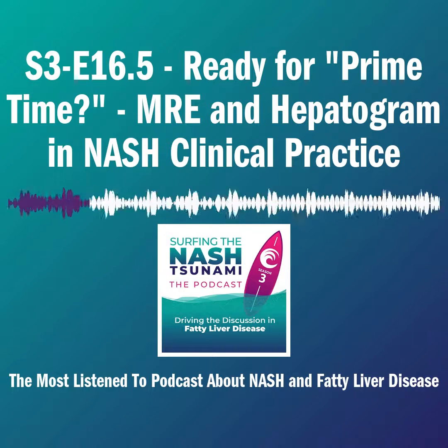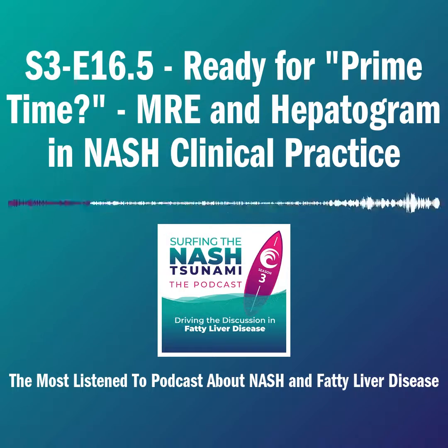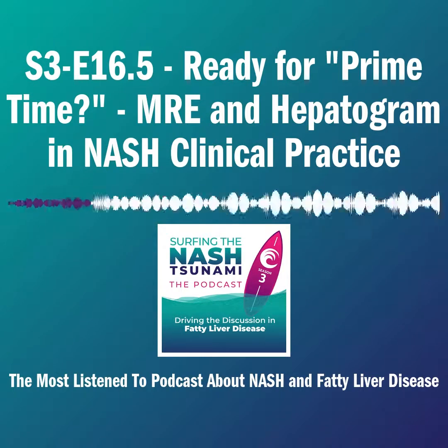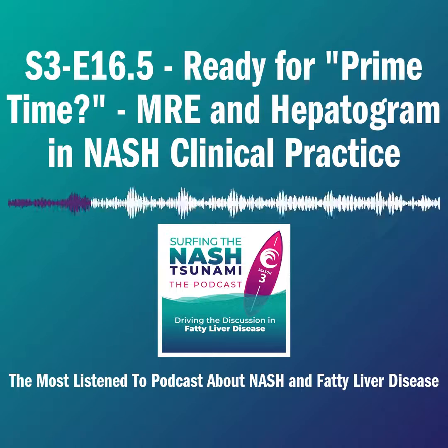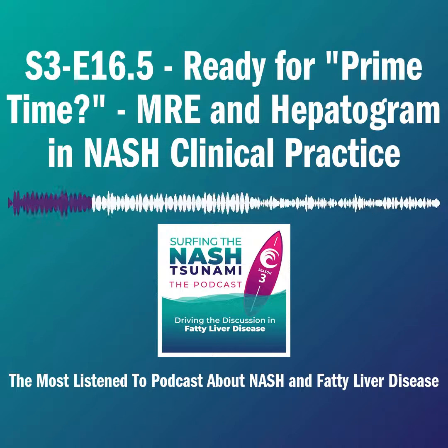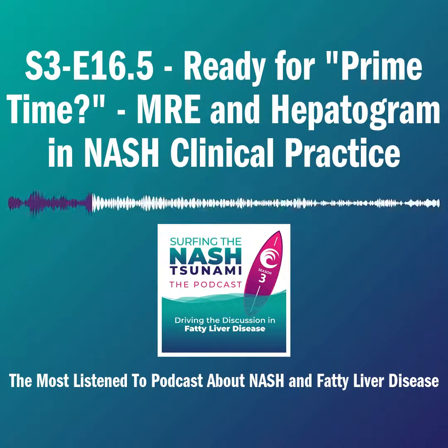So it was a great paper, but when it came out after they presented at the AASLD, I said to myself, well, we have data from UCSD that MRE and PDFF are more accurate than a FibroScan. Why don't we do it a similar way? We do a similar score based on MRI-PDFF and MRE. And that's how we started.